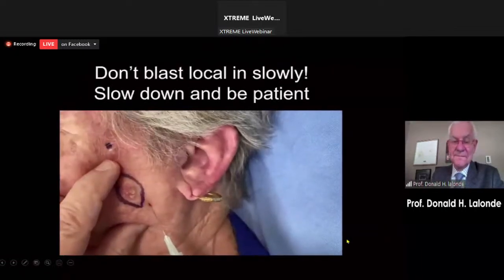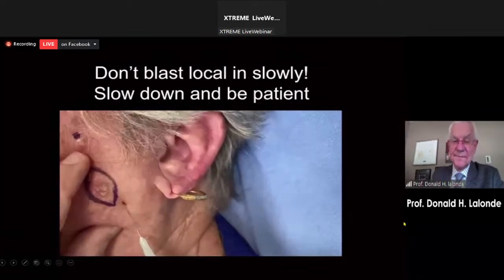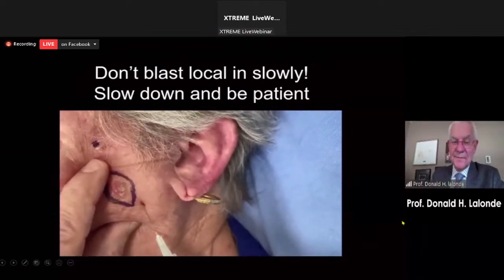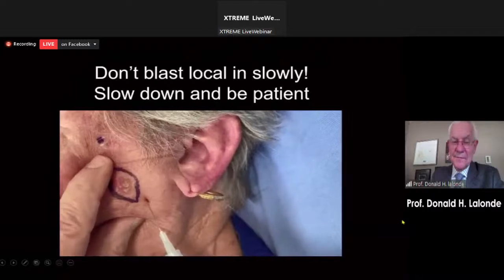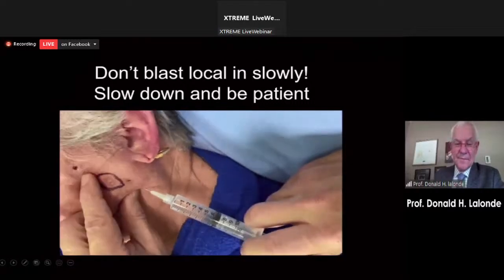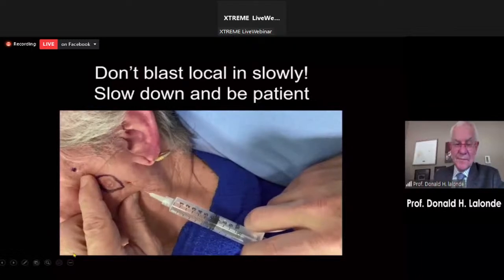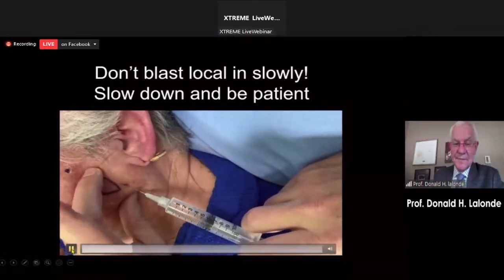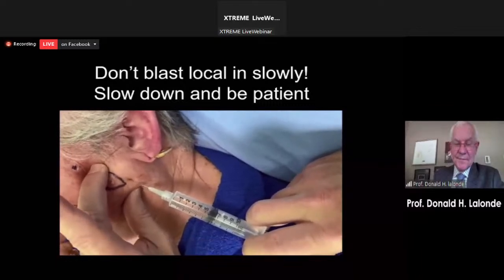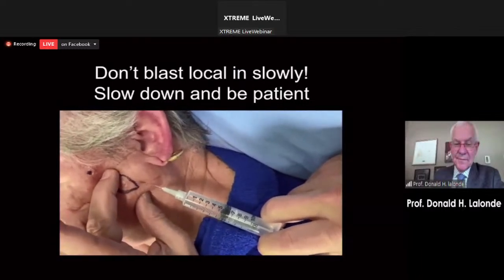Great. So you didn't feel the sting of the needle go in. It's not hurting right now, right? No. Okay. So now blow slow before you go. Can you back up a little bit so you can see my syringe? You can see the stuff going out. Thank you. Blow slow before you go. I'm always thinking that in my head as I advance the needle tip. I always want at least a centimeter of visible or palpable local ahead of my sharp needle tip.